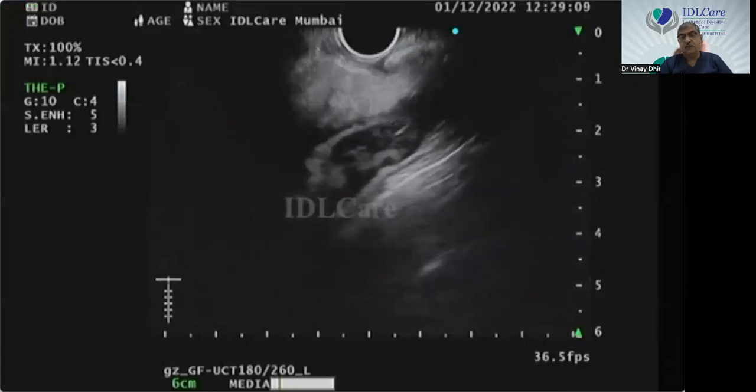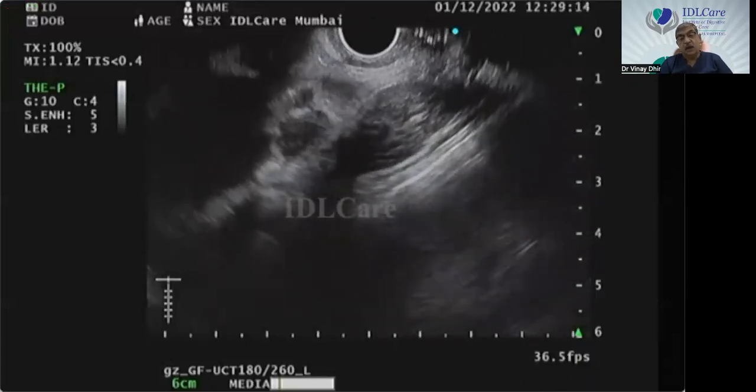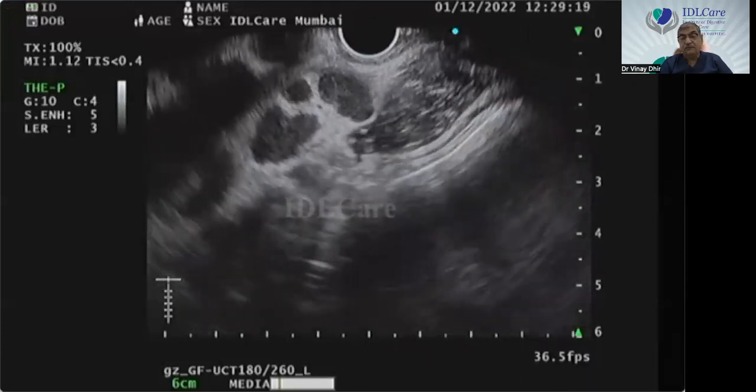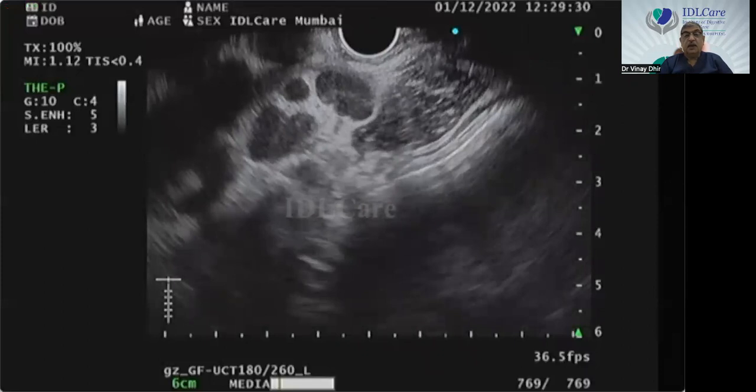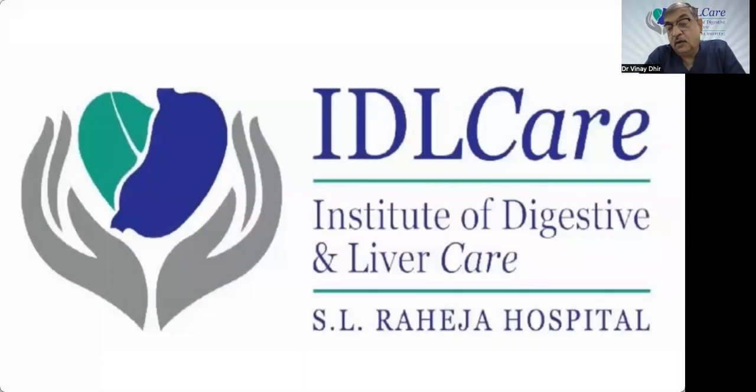It's pretty fast, pretty efficient, and I don't miss intraluminal or extraluminal lesions. I do not have to rotate my echoendoscope because the traditional teaching is every 2 centimeters rotate it 180-degree clockwise and then 180-degree anti-clockwise, so that you are seeing both the walls, around 360 degrees. Probably we do not need that with this method.